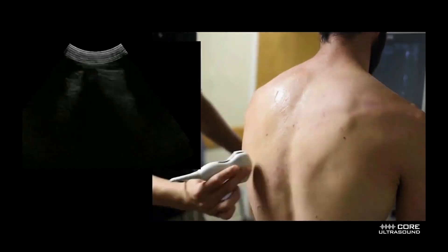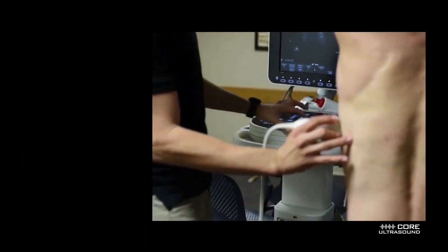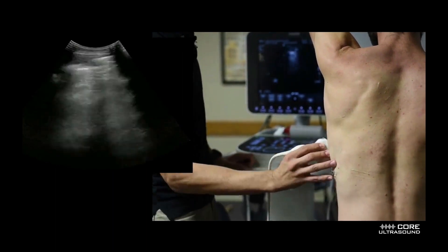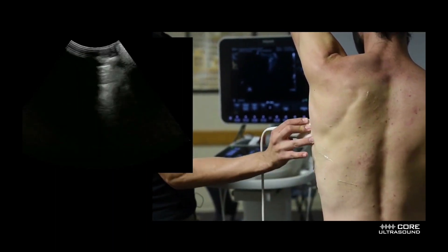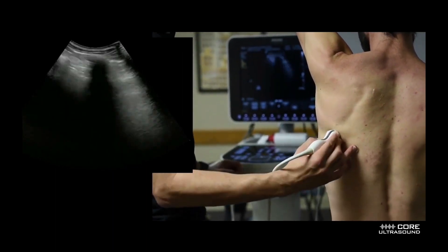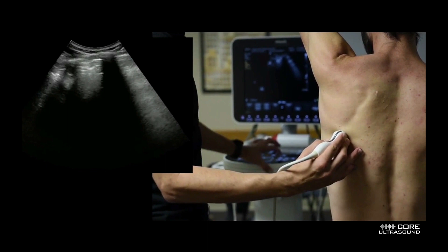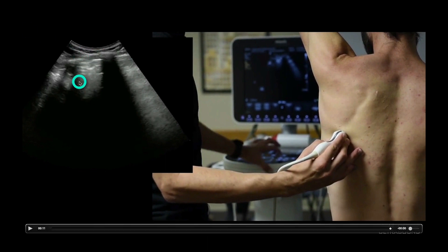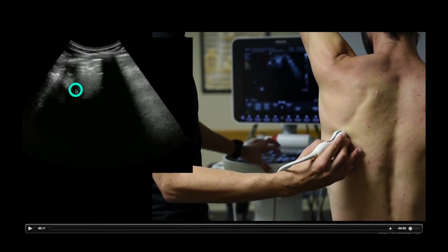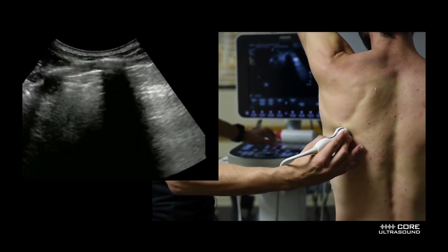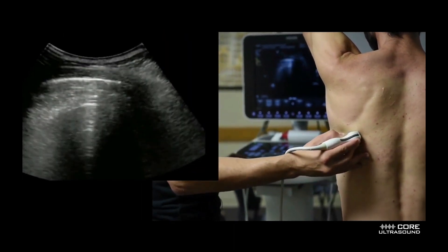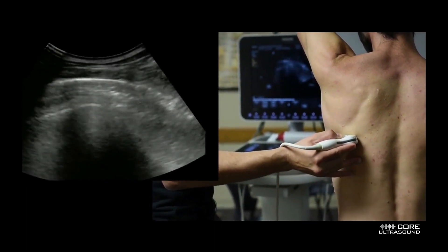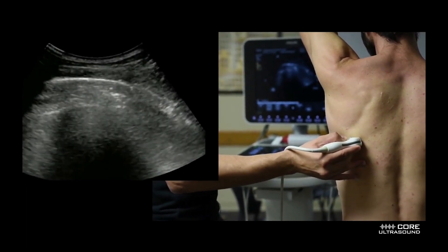Let's say you get to a spot and you're scanning through and you've identified a little area that has something weird in it — some kind of pleural line abnormality right about here. Let's say that off this pleural line you see a couple of focal beelines. What I'll do is turn the transducer transverse in between the ribs and look in that intercostal space to better delineate any pathology that I might see there.